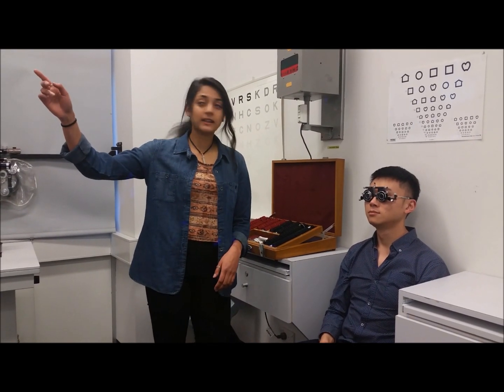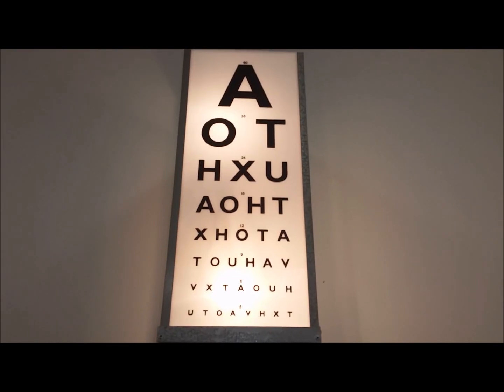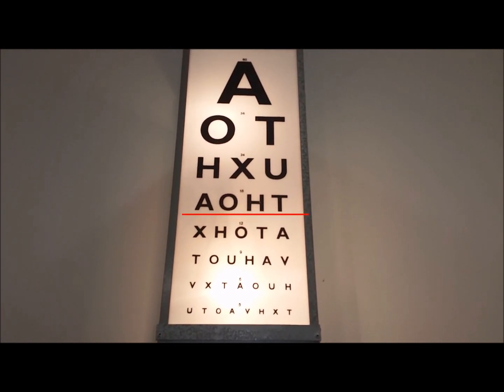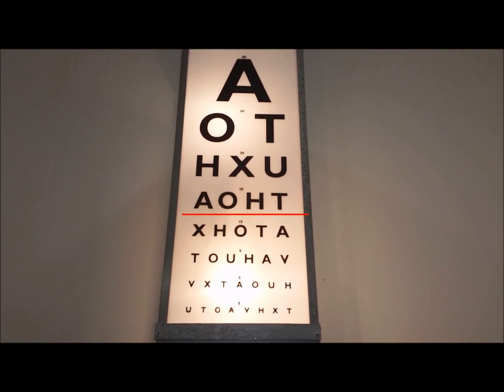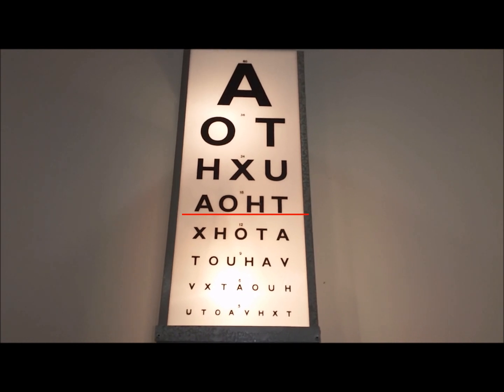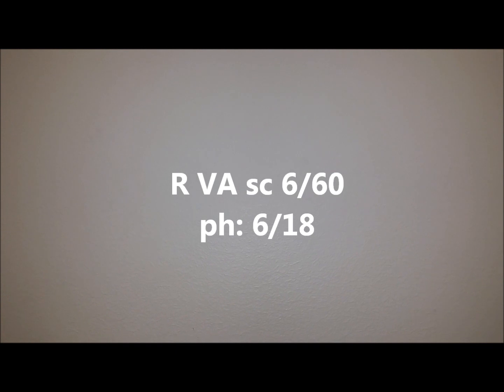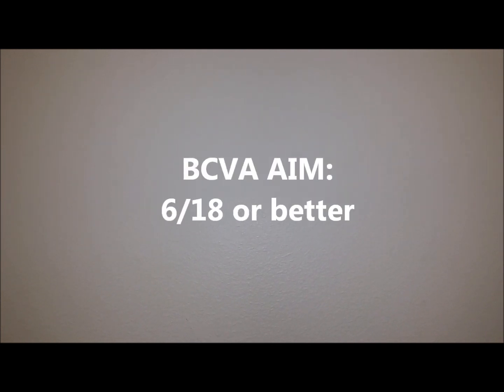Okay, Hongbin, so I'm just going to get you to look up at the chart and do the exact same thing as last time. Just read down to the lowest line you can see now. Now I can see the fourth line. They are A, O, H, T. Yeah, and can you get down any further for me? No, I can't. With the use of the pinhole, Hongbin's vision has now improved to 6/18. The orthoptist aims to equal or better this level of visual acuity by the end of this assessment.